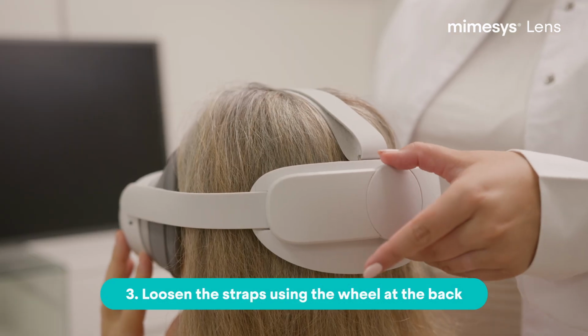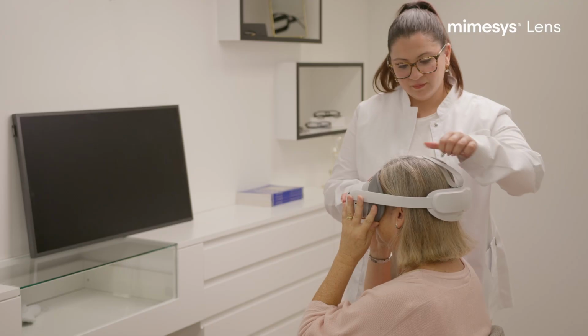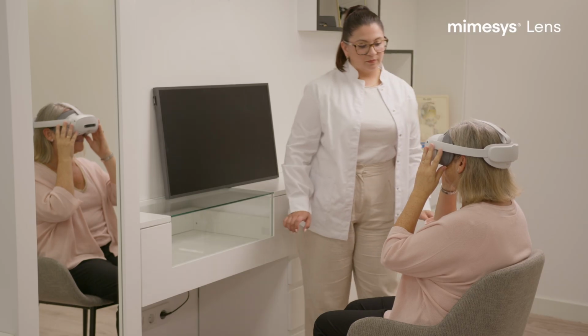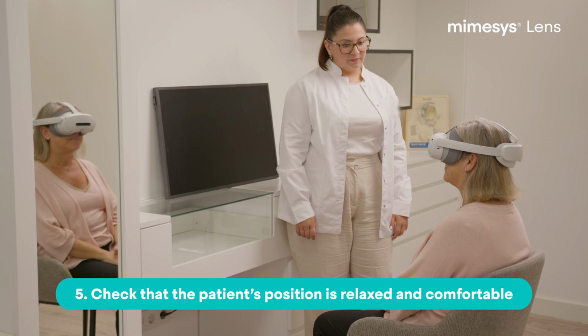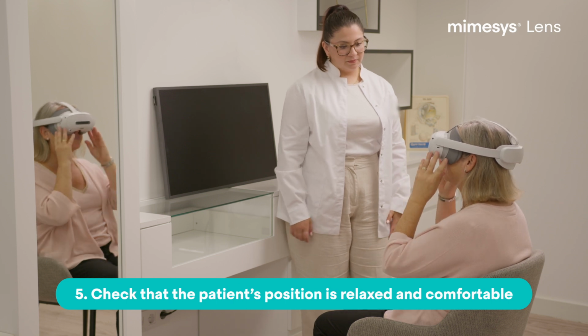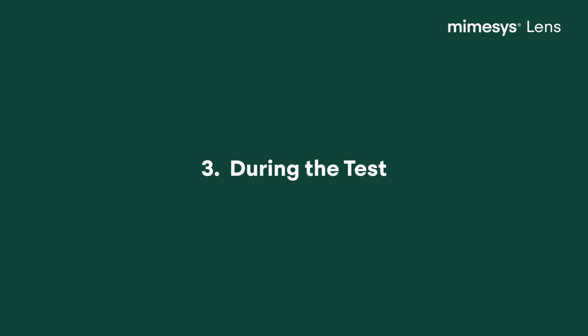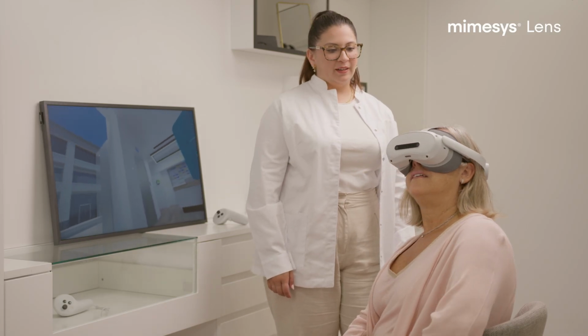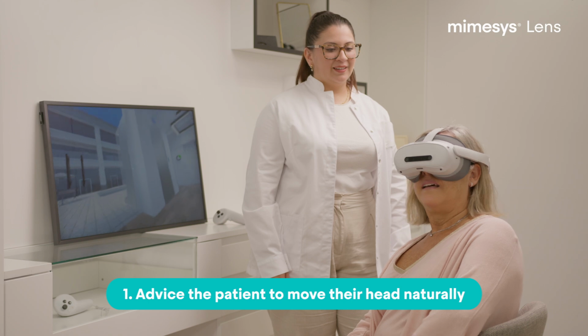Loosen the straps using the wheel at the back of the device, and then adjust the top strap without over-tightening. Check the sitting position of the patient. The patient should be relaxed and comfortable. Advise the patient to move their head with ease and not force the movement.